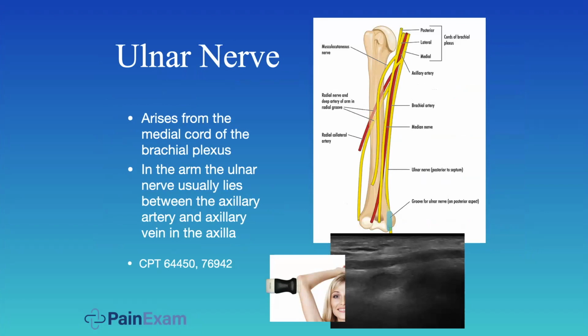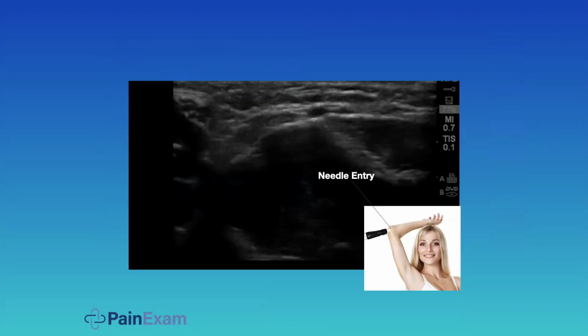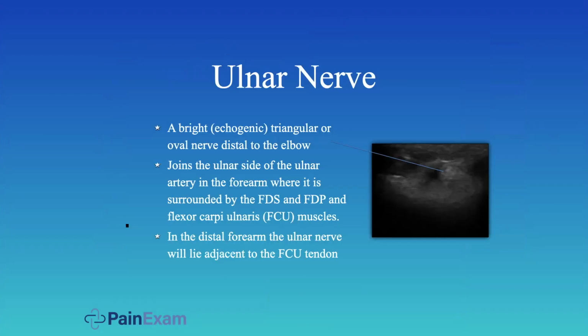Once again, we discussed earlier about the ulnar nerve. I'm not going to spend too much time on this, but just note here in the picture, you see the ulnar nerve going through the groove by the canal, which we talked about earlier. And that's an image of the ulnar nerve in the longitudinal view, before we saw the cross-section view. We watched this video already.